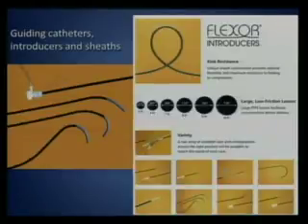It means that the size of the catheter is totally 6 French. They come in different shapes and sizes, so you can use different shapes, like I told you. And the sheath actually is different. The size of the sheath is the actual size of catheter it can accommodate.